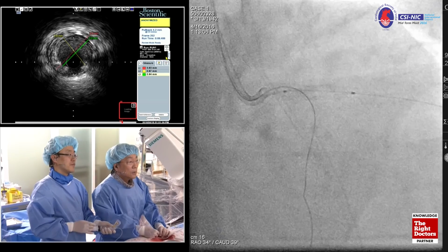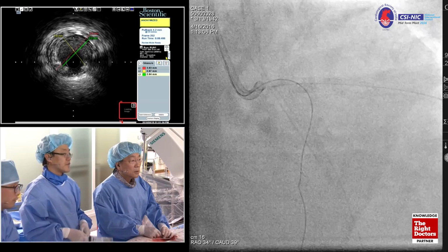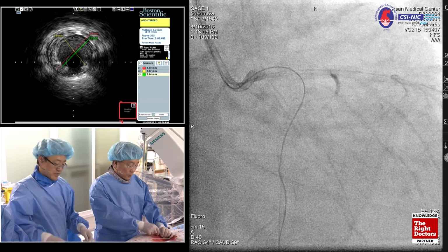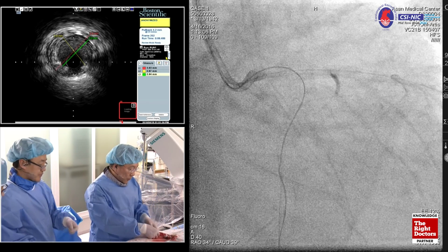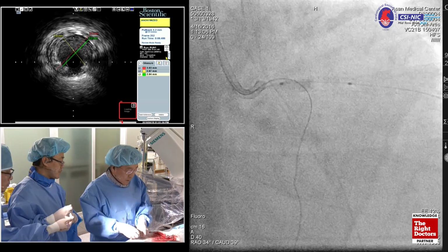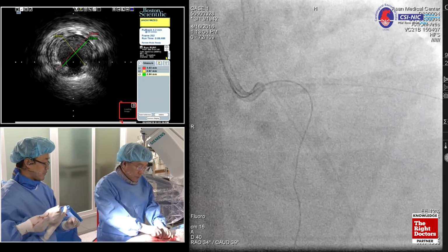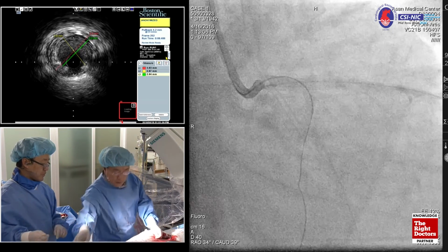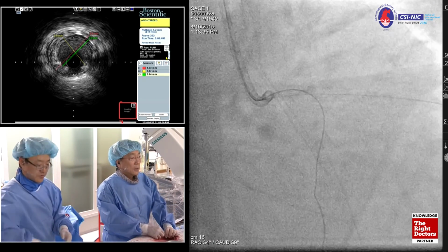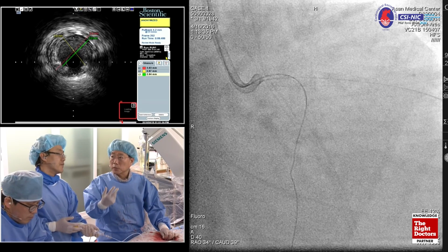And then we're going to see what happened. Okay, test please. What do you think? Good, big changes, better. Still, we have other options: another drug stent for the LAD and left main. However, I still believe less metal may be better, and too much metal for another drug stent there.